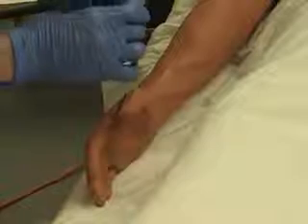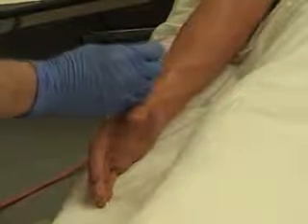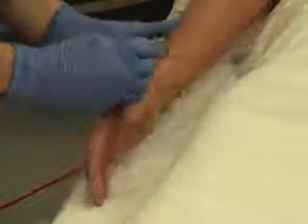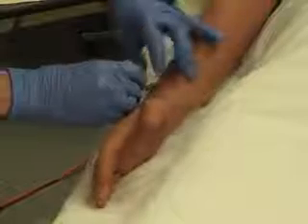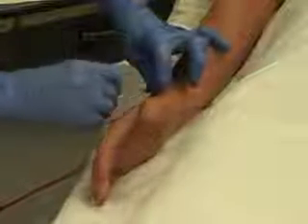Let's get a closer look. When you're ready to insert the catheter into the skin, remember you're really making 2 pokes, one poke into the skin and one poke into the vein. Advance the catheter into the vein and thread it off the needle.